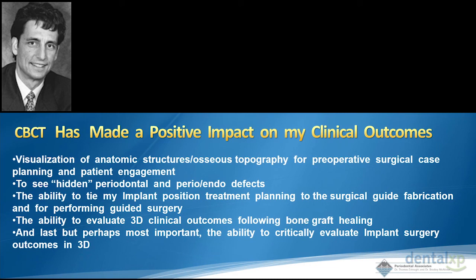And with these low radiation CT scanners of reasonable cost, I think now we're at an era where we can really turn things into a 3-dimensional office rather than a 2-dimensional historic type perspective.